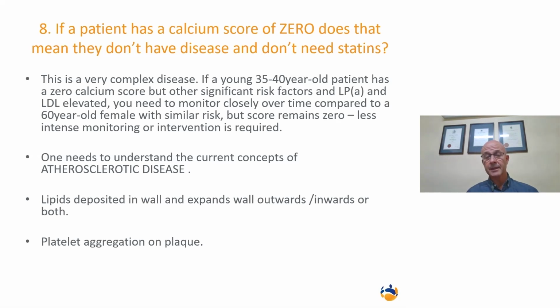I just might add that a CT coronary angiogram with contrast, excluding any plaque, both soft and calcified, would make me a little bit more comfortable to choose lifestyle choices and treat other risk factors than to rush in with long-term statin therapy, because as we all know, atherosclerotic disease is an inflammatory condition with multiple risk factors and it is not only the cholesterol that plays a role.